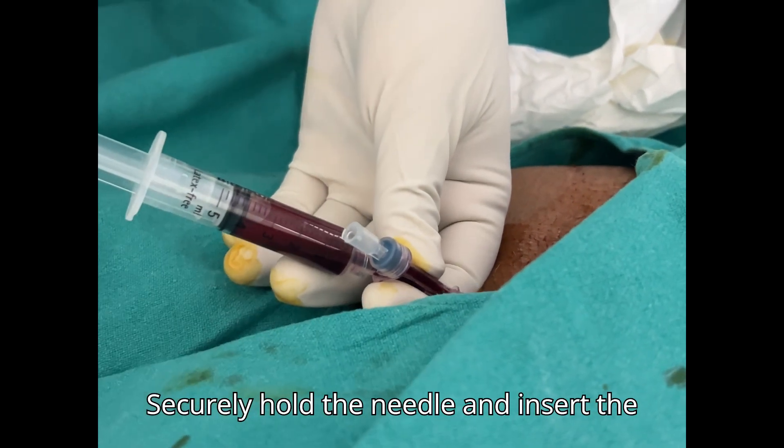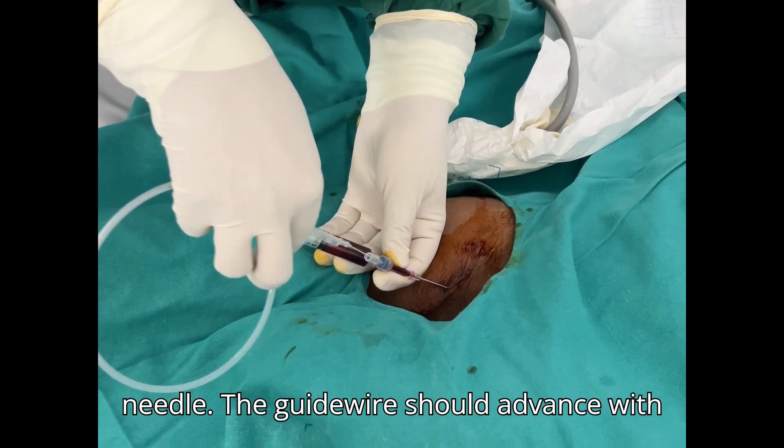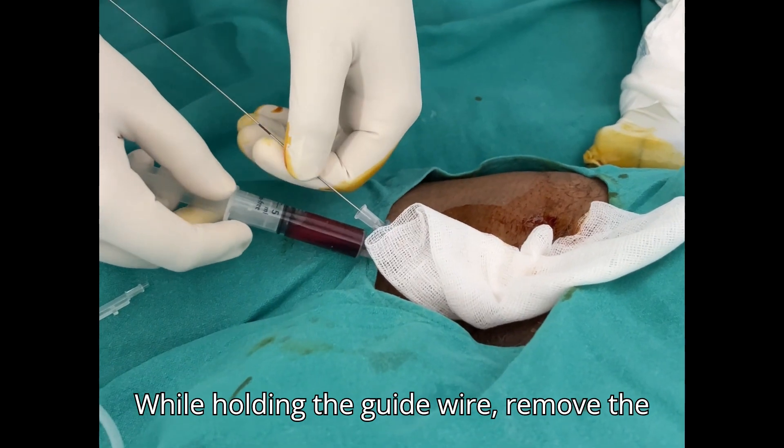Securely hold the needle and insert the guide wire from the side port of the introducer needle. The guide wire should advance with little resistance. While holding the guide wire, remove the introducer needle.